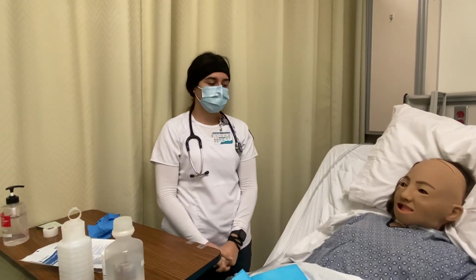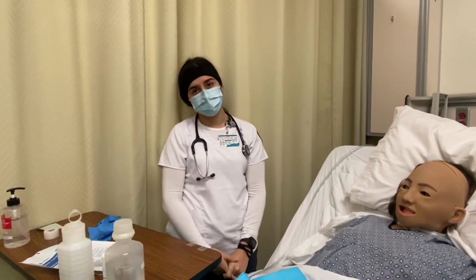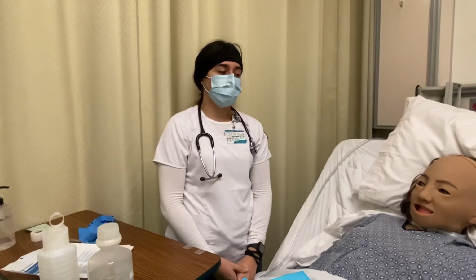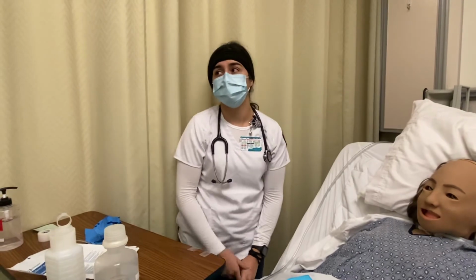Okay, so what I'm going to do today is NG tube insertion. Before I enter the patient's room, I'm going to make sure that the doctor requested an order for an NG tube for the patient. Once I double check that, I gather my supplies, and then I go in the room.